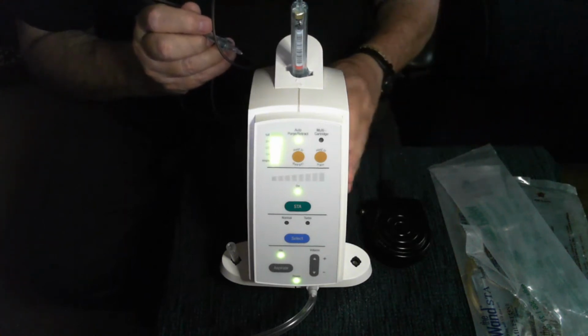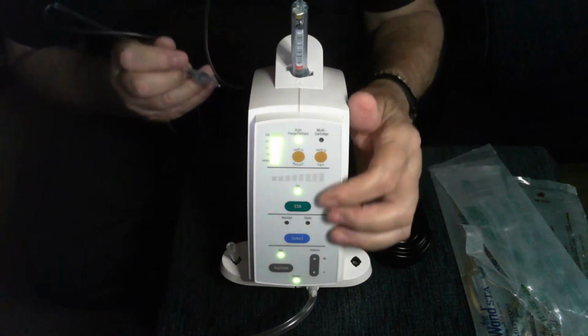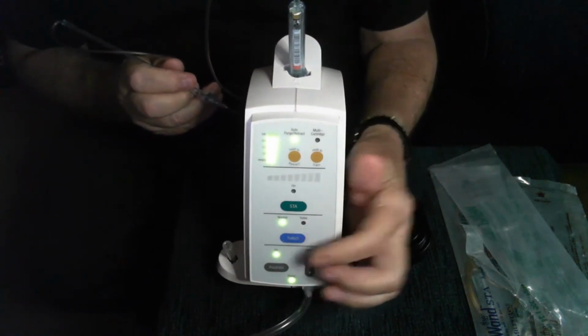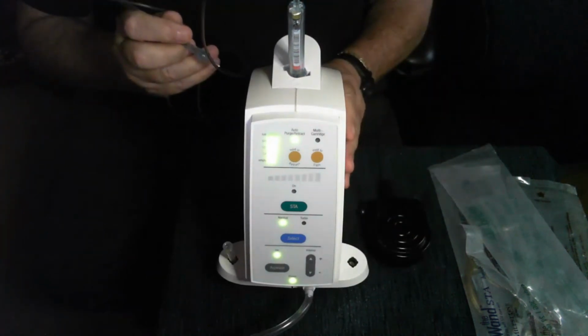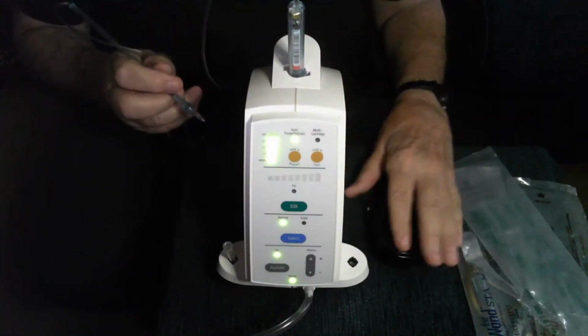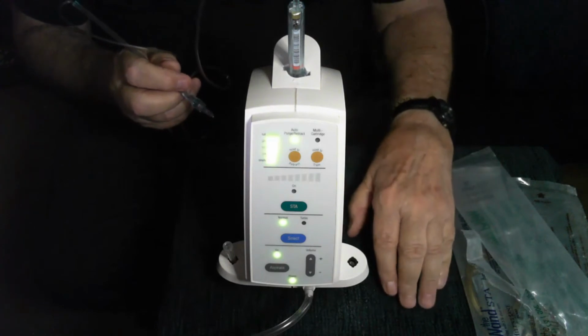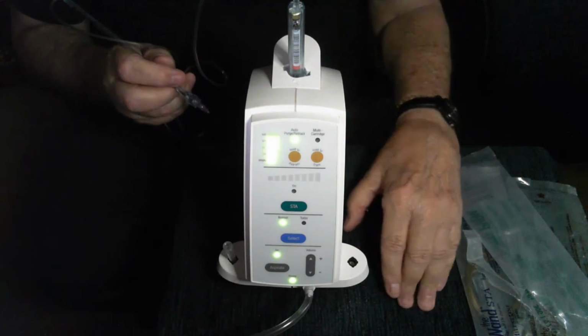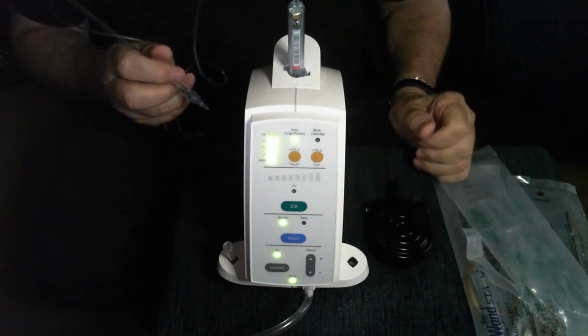So I showed you that there was 2 speeds that we normally can use. So if I hit the select button once again and go to normal mode, you're going to see that we have 2 flow rates. So if I depress the foot pedal part way down, we enter what we call cruise control.